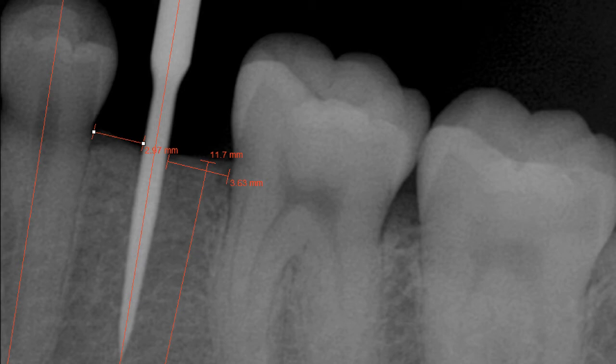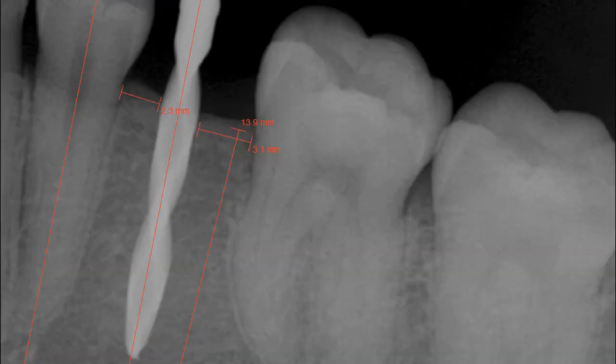In this particular case, I found that I had deviated slightly towards the mesial. I would have rather positioned myself a little bit distally to be equidistant between the premolar and the molar. These measurements show approximately a 0.6 millimeter deviation that can be corrected with the following drill, or with a Linderman drill, which is more like a crosscut Fisher burr. Moving on.